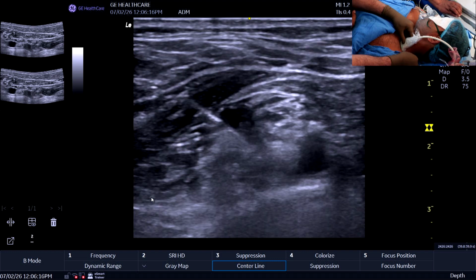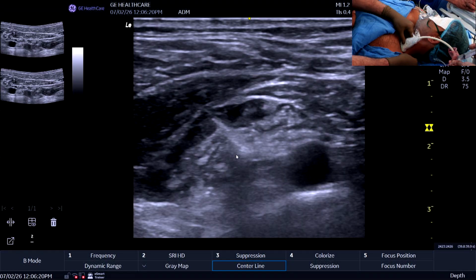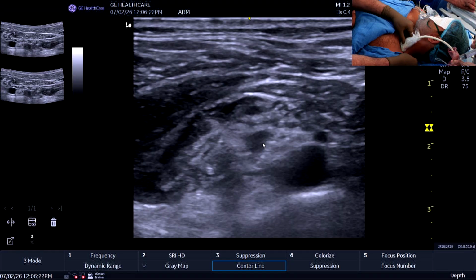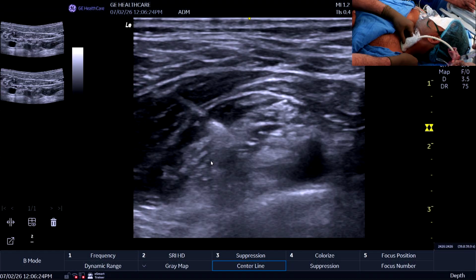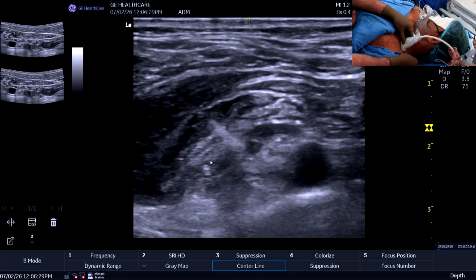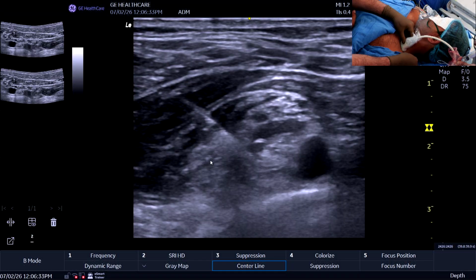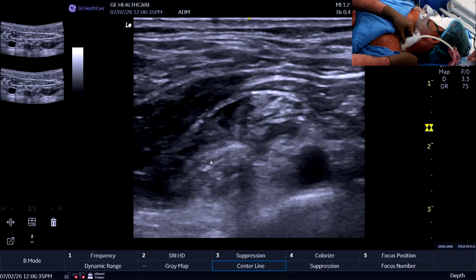So just at the lateral border, you don't have to go right inside. Yeah, small volume. Yes. Can you see how it dissects from the fascia? So that should be the way the brachial plexus blocks should be given. This is again just engulfing the superior trunk. You can advance your needle a bit here at this point. Yeah, inject please.